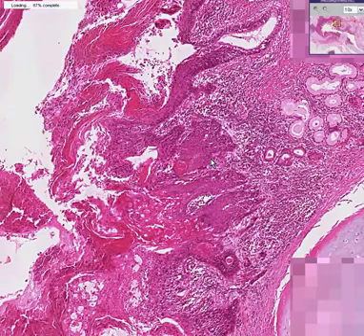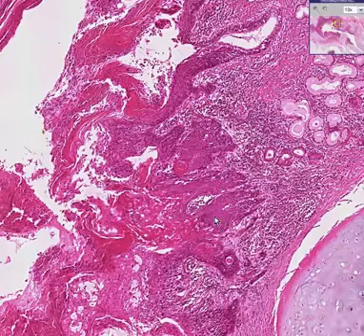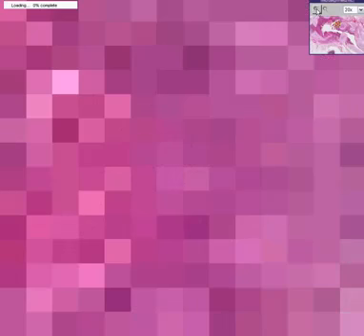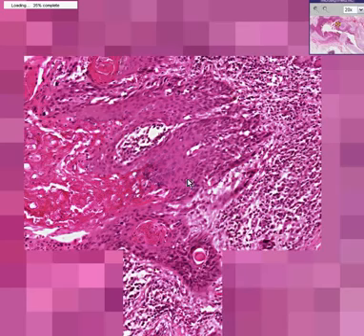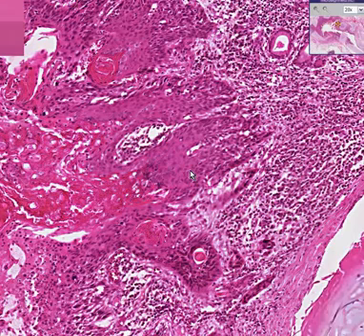If this pearl was not present, however, and all you had, for example, were tumor nests like this, and you just happened to see in this tumor nest intercellular bridges between the infiltrating squamous tumor cells, then you could call this probably a moderately differentiated squamous cell carcinoma. We can't go any higher. I wish I could find bridges. They're in the little clear spaces between tumor cells, and they look like little steps in the ladder.